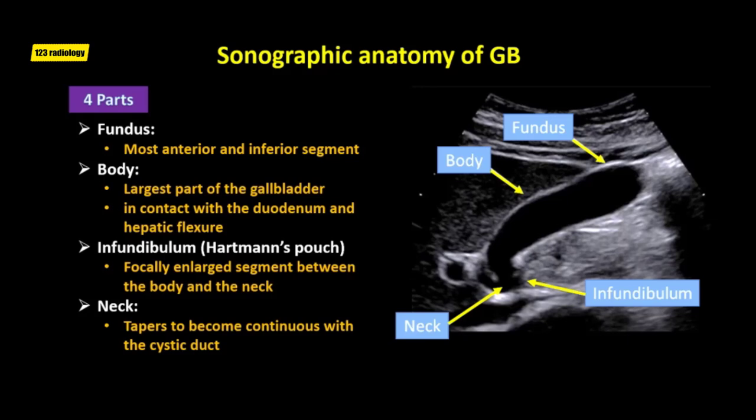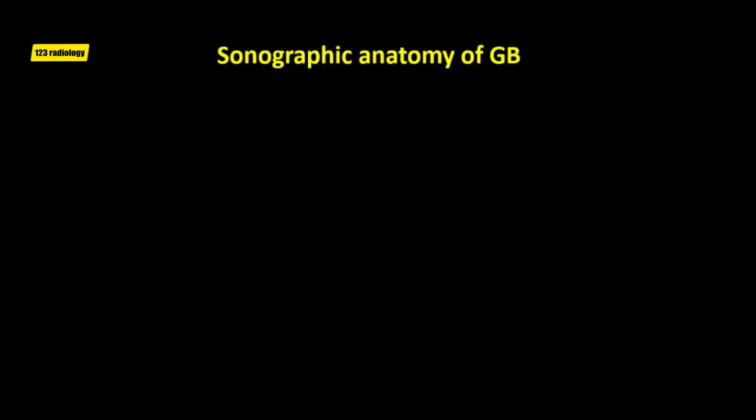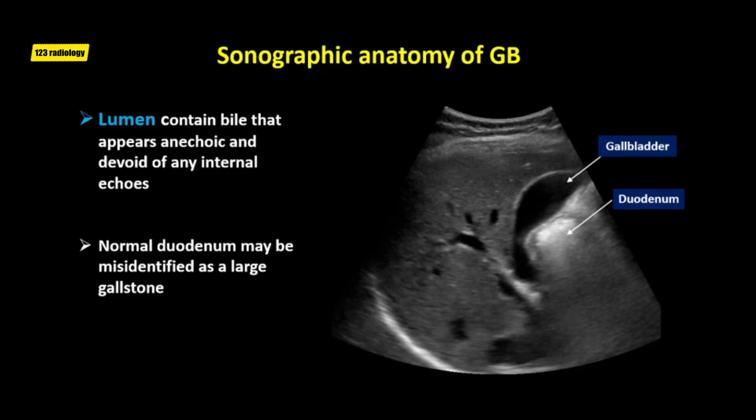The neck of the gallbladder lies between the body and the cystic duct and points toward the porta hepatis. The normal gallbladder lumen should contain bile and should not have any space-occupying lesions. Normal bile appears anechoic and devoid of any internal echoes. On ultrasound, a large echogenic reflector with posterior dirty shadowing abutting the gallbladder body and neck is actually bowel gas, which should not be confused for a stone or gas in the gallbladder.